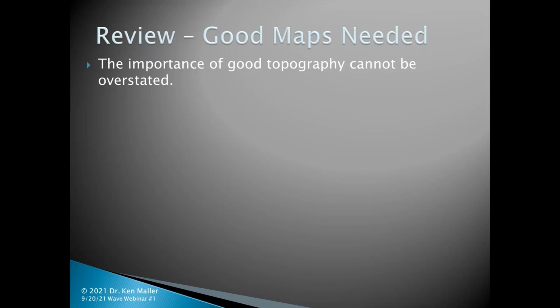And so you absolutely need to give whoever is going to be doing the topography enough proper training so that they can be discriminating during the captures. And then you, when you sit down to design up a lens, need to be even more discriminating and critical of those captures to make sure that they really do look proper.